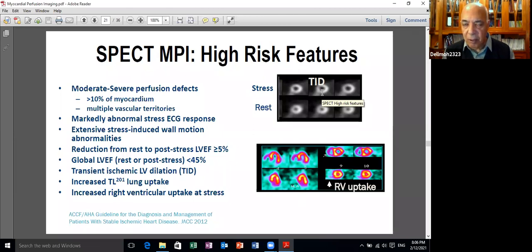So if you take these patients to the echo, you will find that the outer perimeter of the cardiac silhouette is not increased in the large majority of cases. So this is transient ischemic dilatation. It's not a solid sign for balanced ischemia or extensive ischemia, but it's an important sign. Because it's not a solid sign, it should be taken in the context of the other parameters in every specific patient, as we will see in the subsequent slides.